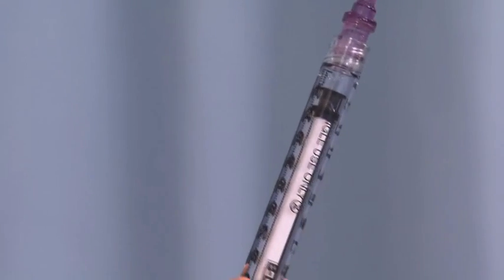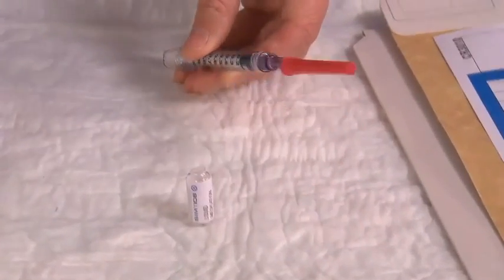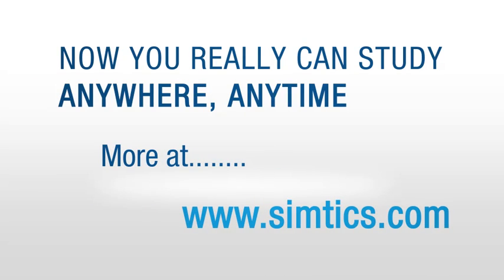Ensure that the correct dose has been drawn up. Recap the needle using the one-hand technique, or remove the filter needle without recapping and discard it into the biohazard sharps container.